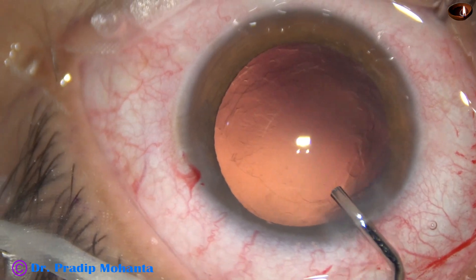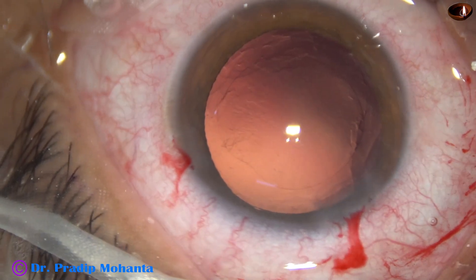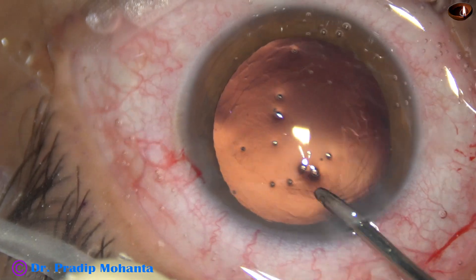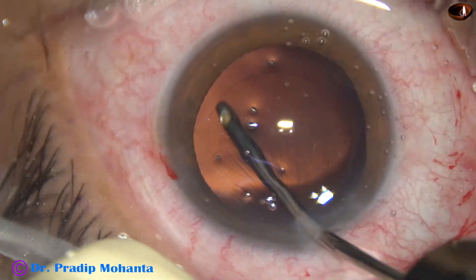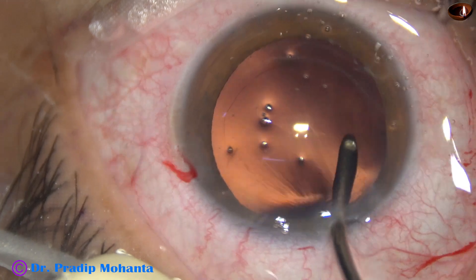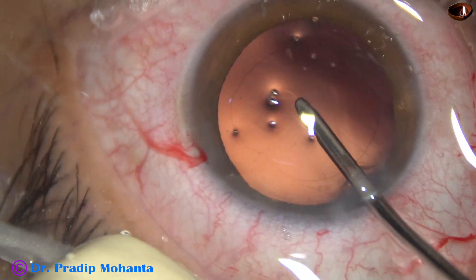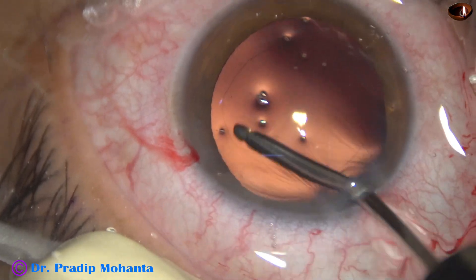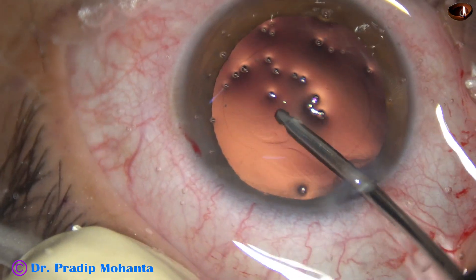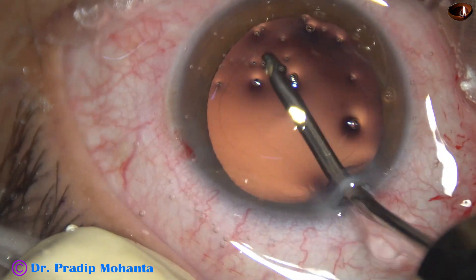A little bit of visco to maintain the anterior chamber depth. Now I am using the irrigating probe of bi-manual IA to polish the posterior capsule. The irrigating probe is turned so that one jet of fluid is directed towards the posterior capsule. It is swept over the posterior capsule and thus all the cells that stick to the posterior capsule get dislodged, and the posterior capsule becomes clear and shiny.